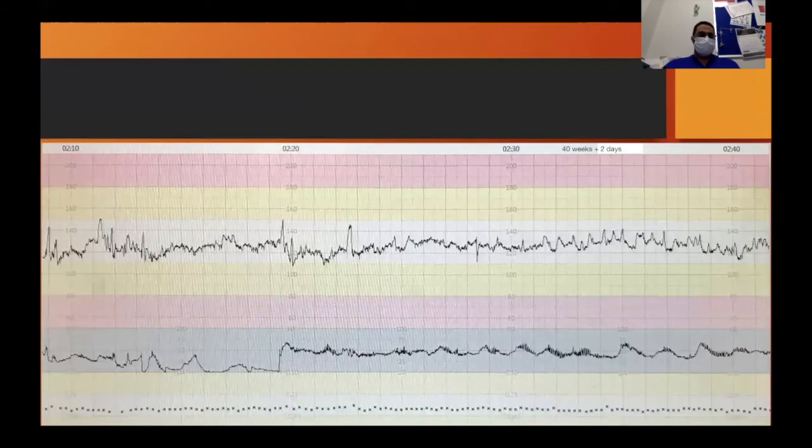So for our current baby, baseline has remained pretty much the same. She is contracting well, it's not picking up properly here, but let's say 1, 2, 3, 4, 5. Some of them are 90 seconds apart. Some of them are not. They're not very regular, as you can see. But she seems to be progressing, so I pretty much don't need to do anything else. And baby's fine. Stan is also keeping a close eye, and Stan is also happy.